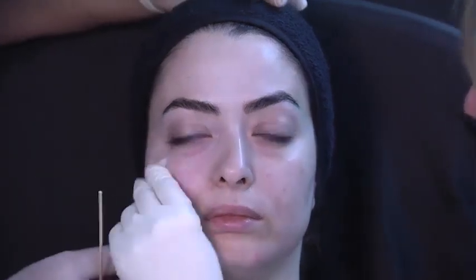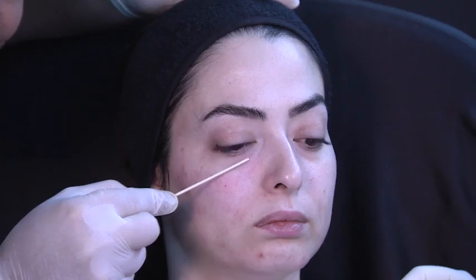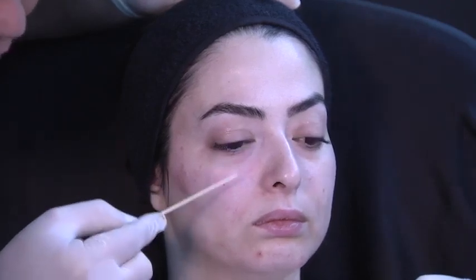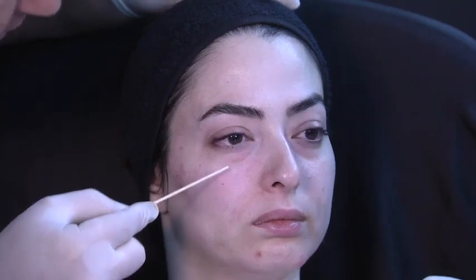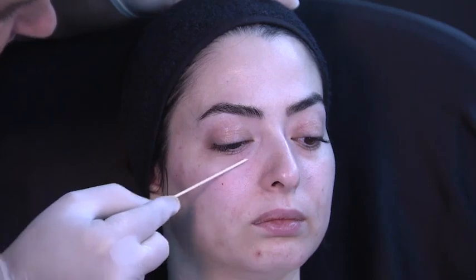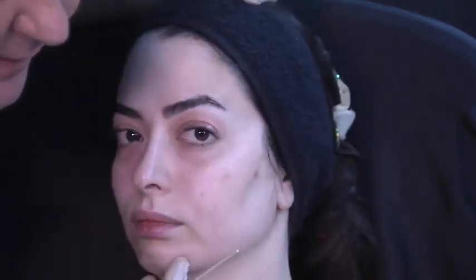Right, the classical way, but I want to show you one thing on her, okay, which is the lateral approach. I'm not going to do the superficial now. I just want to show you the lateral approach. Can you open your eyes? Right. So she still needs a little bit, okay, she has eye bags. Be careful with patients that do have eye bags, the herniation of the fat in this area, because if I try to correct 100%, part of this product can herniate through the muscle as well.